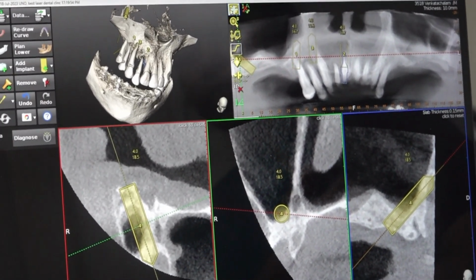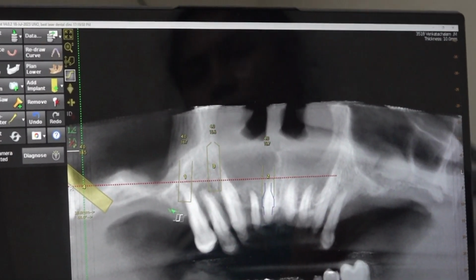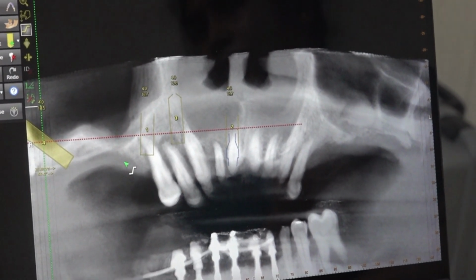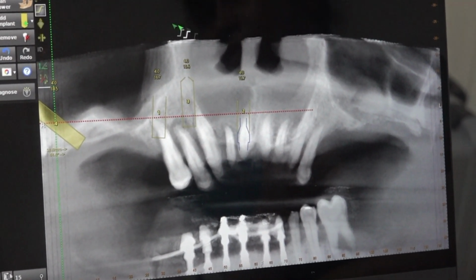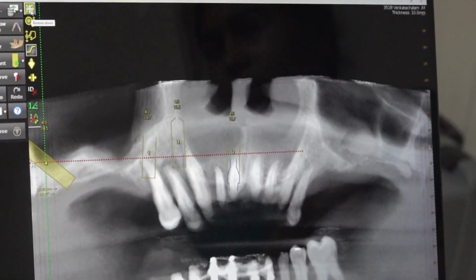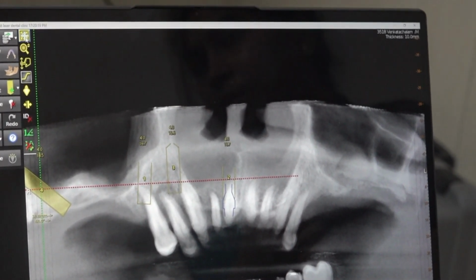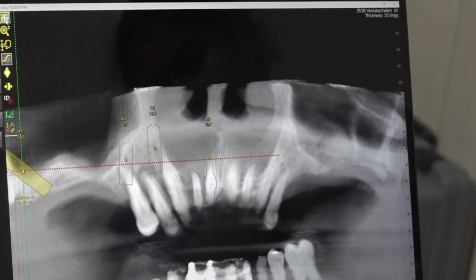But in this situation, I feel if you place these 3 implants well, that is more than enough. We can give a cantilever. You can give one molar cantilever, nothing wrong. Cantilever is accepted if you are giving screw-retained prosthesis. Anyway, we are going to give a titanium milled bar, so over the bar you can give the prosthesis with one molar cantilever.